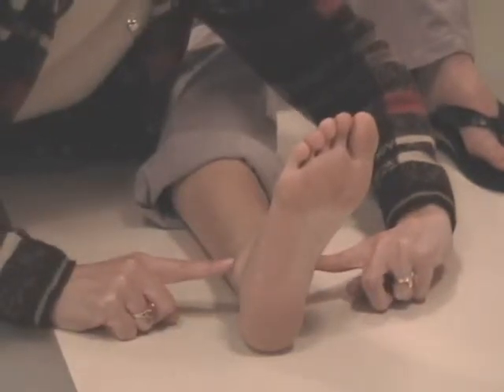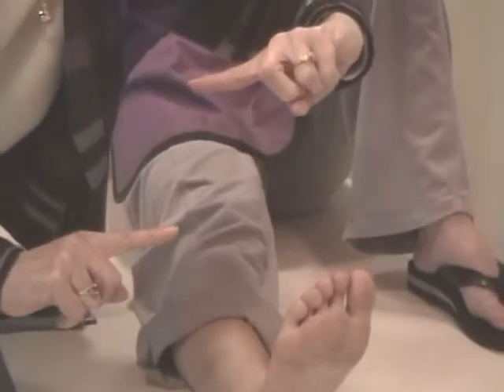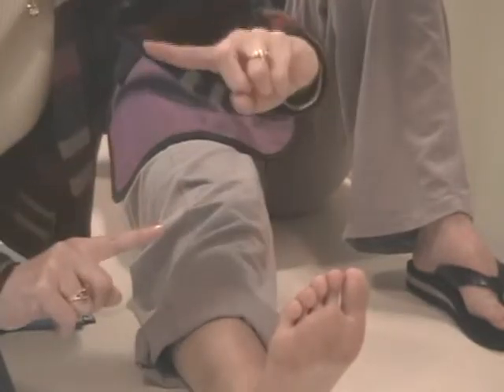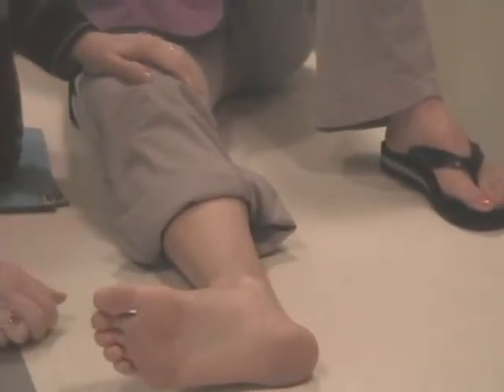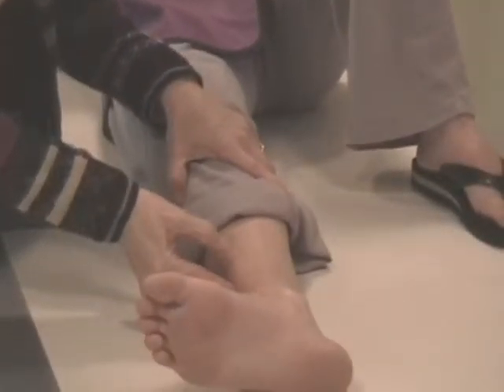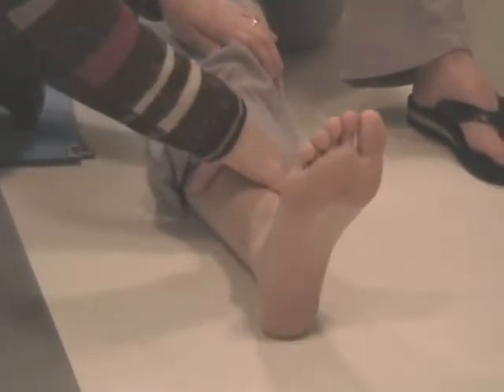If it's parallel, 90 degrees becomes perpendicular. Rather than parallel, it becomes perpendicular. And our lateral, we want the malleoli superimposed. We want the intermalleolar line perpendicular, in other words. So our lateral is with the foot slightly up off the cassette, approximately 15 degrees. It's 90 degrees opposite our AP mortis.